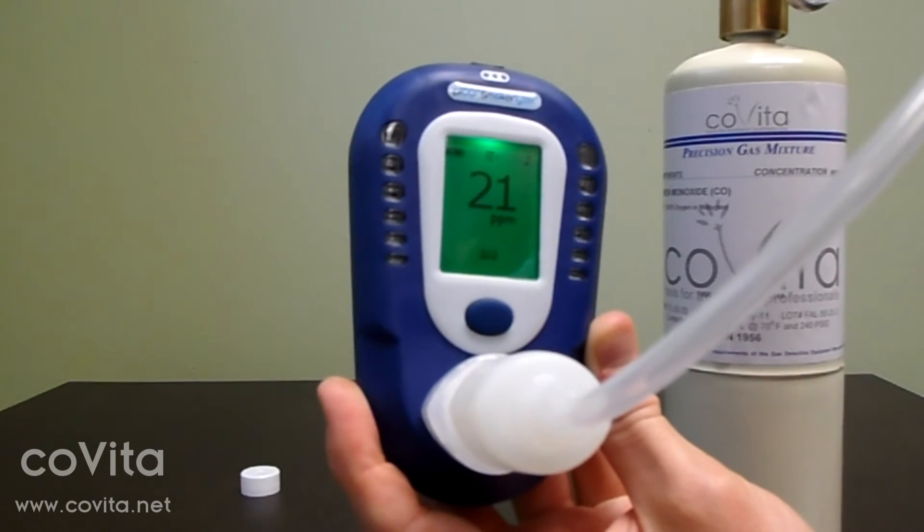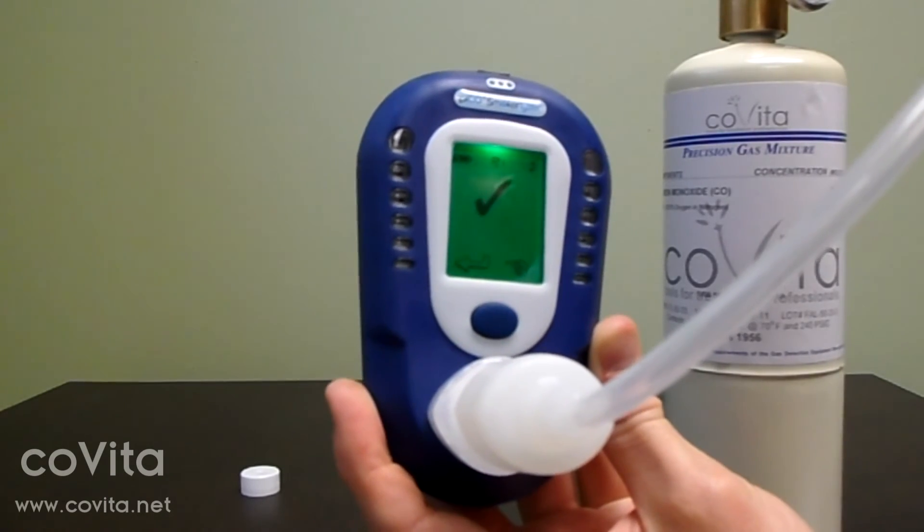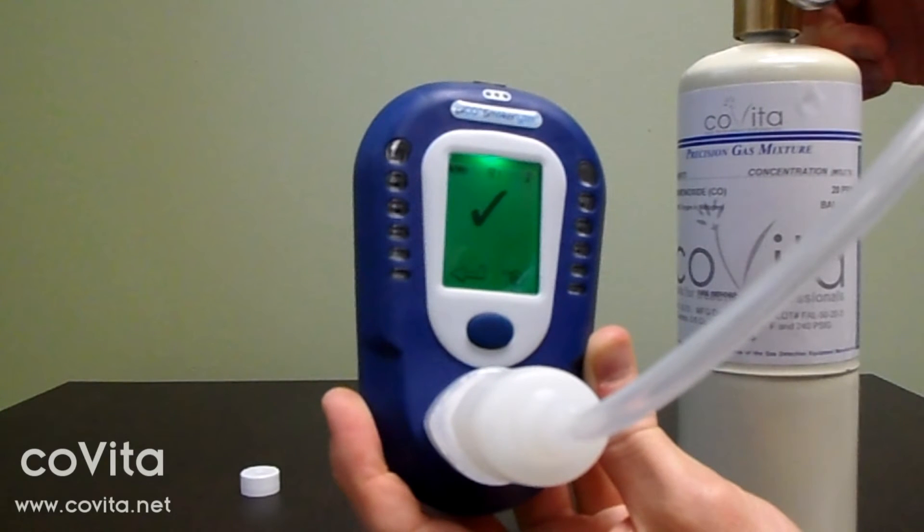Some end users may find it more convenient to lay the can on its side during calibration. Allow the gas to flow and don't worry about the number you see on the screen. Calibration is complete when you've received a check mark or an X on the screen. Immediately turn off your gas.